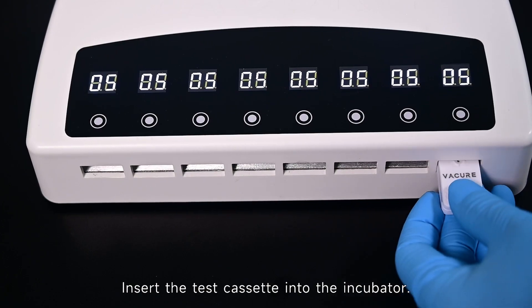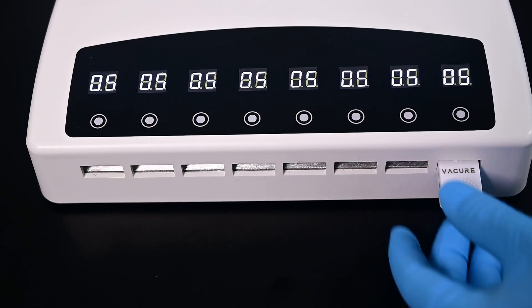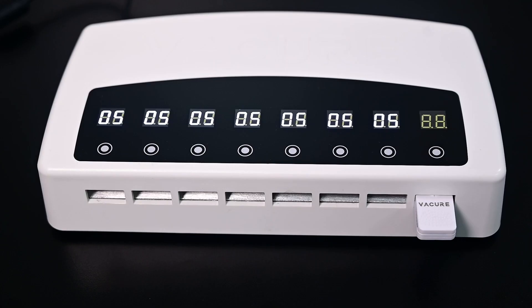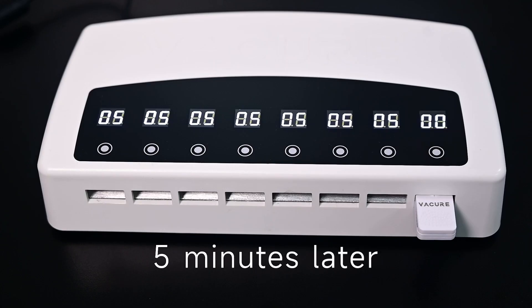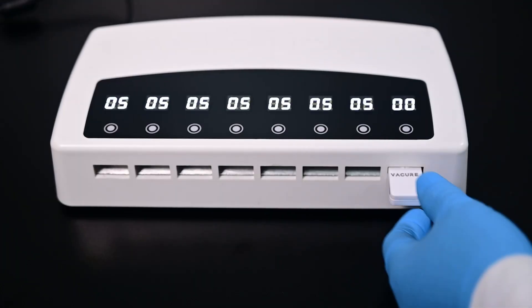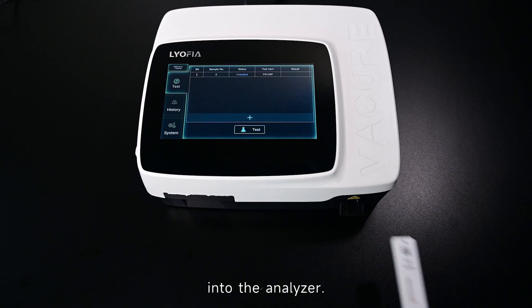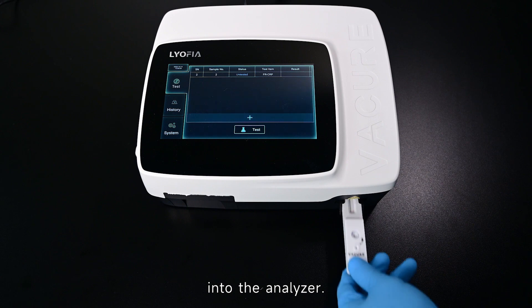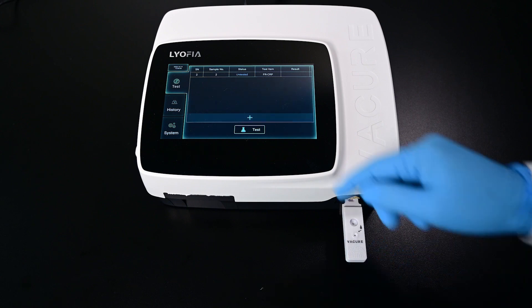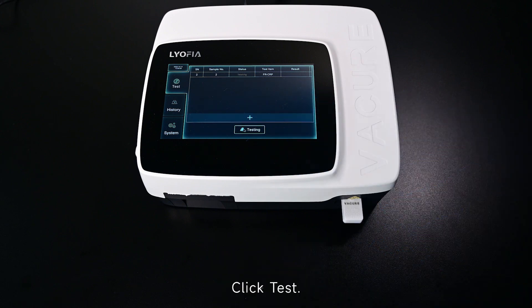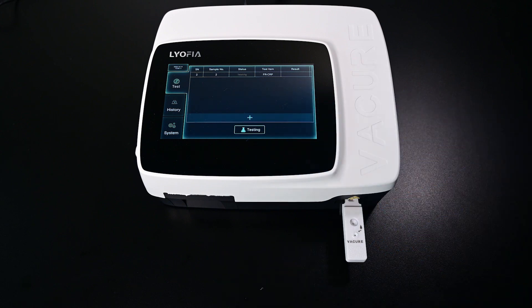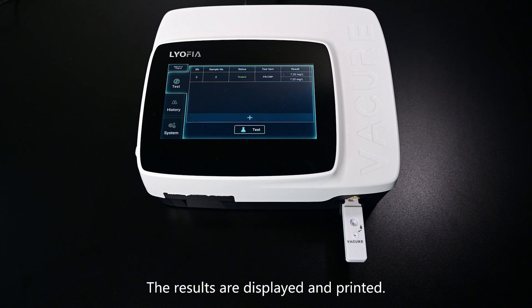Insert the test cassette into the incubator and incubate for 5 minutes. Remove it and place it into the analyzer. Click Test.